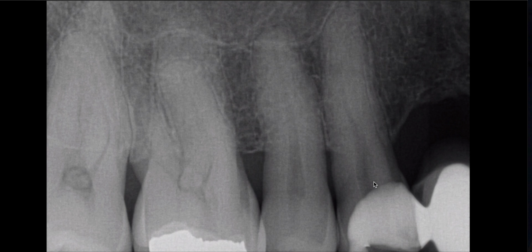How do you confirm? You could send for a cone beam, and then you know exactly what the configuration is. We don't have a cone beam in-house; it has to go downtown. So we'll use a scope, and if there's any anomaly during the procedure, then we will send for a cone beam. Otherwise, off we go. Let's talk about how to unblock the canals that you block. It happens to us all.